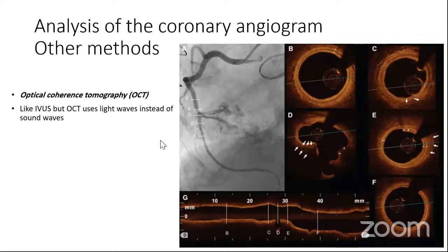Another method is optical coherence tomography, or the OCT. It's like the ultrasound, but it uses light waves instead of sound waves to construct the image.